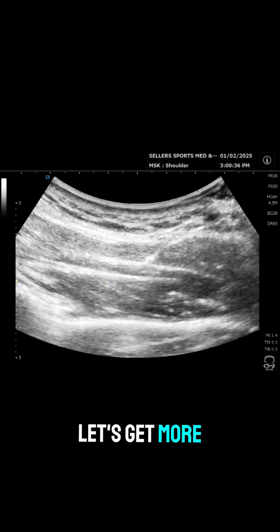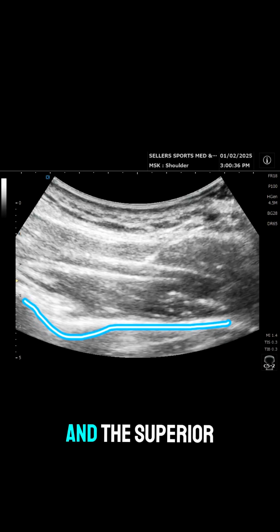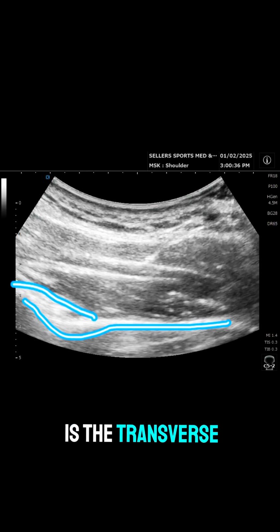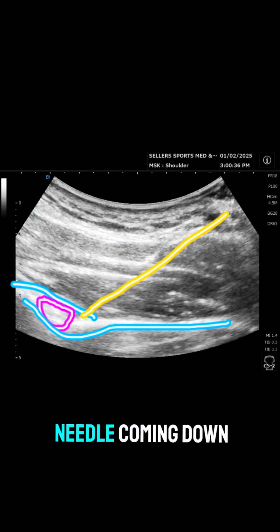Let's get more acquainted with the anatomy. So here we have the suprascapular notch and the superior border of the scapula. Overlying the suprascapular notch is the transverse scapular ligament, and right in between the ligament and the notch is the suprascapular nerve. Over here we see the needle coming down right into that space.